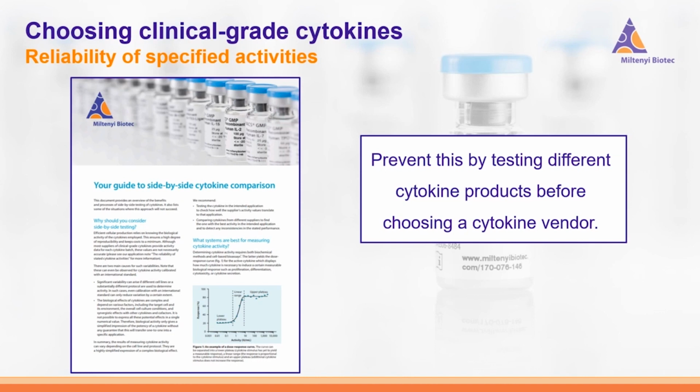So not only will you realize if there are unreliable activities, but what you will also realize is if the cytokine works well in the context of your process. Yeah? Because what you also have to remember is that all these activity data that you see on these data sheets and certificates of analysis, it's all data derived from artificial bioassays. Yeah? This is the gold standard, and this is the best that you can do from a supplier perspective, but it doesn't necessarily mean that it also works exactly the same in your manufacturing process.